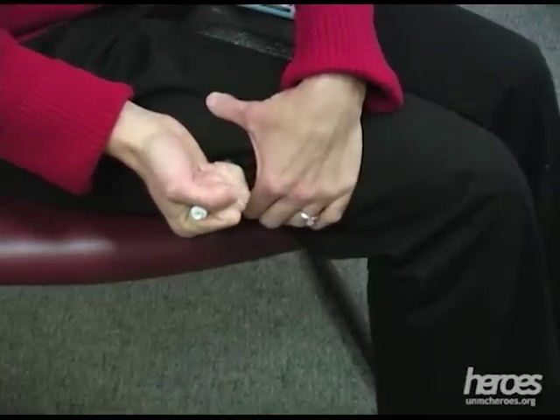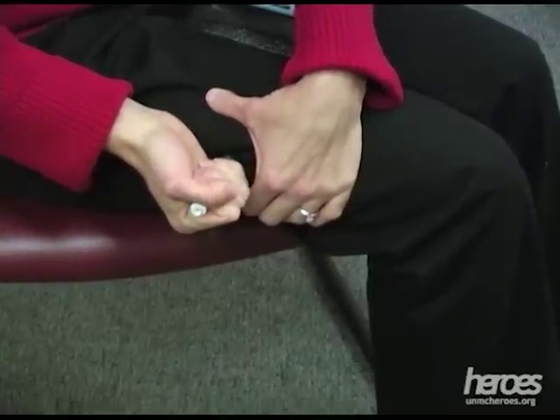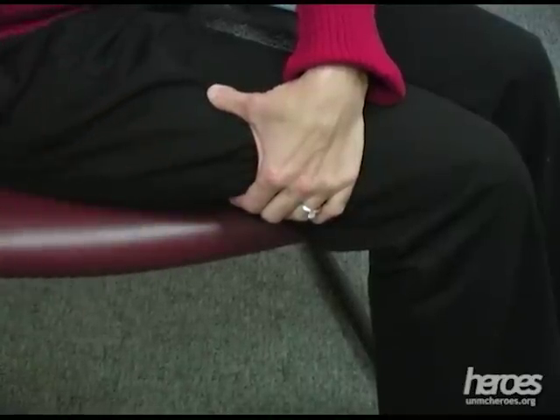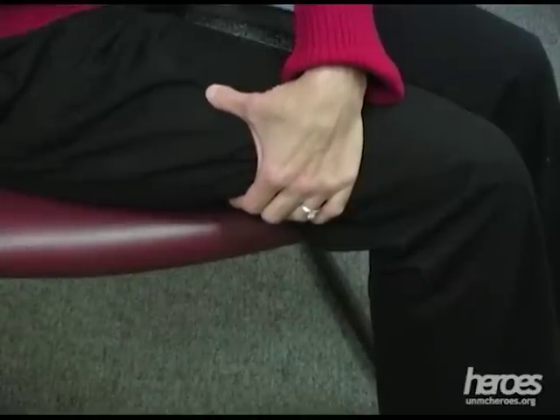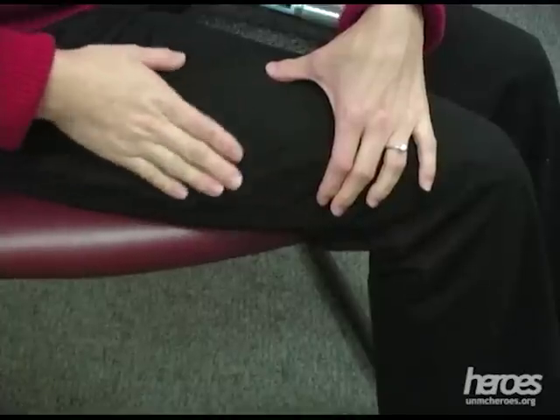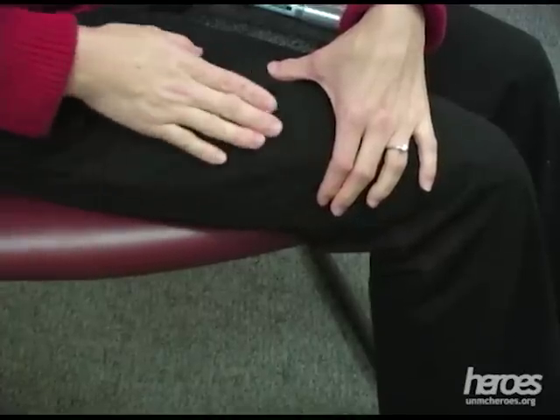Hold the auto-injector in place for at least 10 seconds to allow the injection to finish. Remove the auto-injector and massage the site for several seconds. Place the first auto-injector in a safe place away from you or the patient.